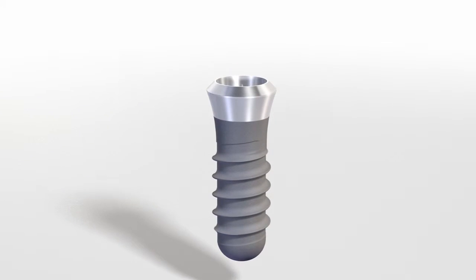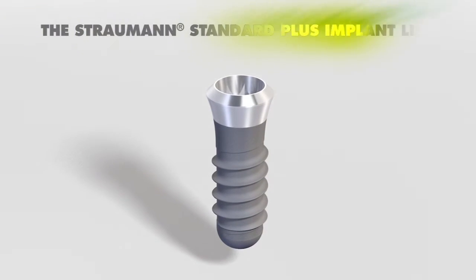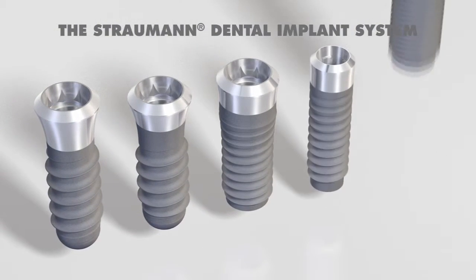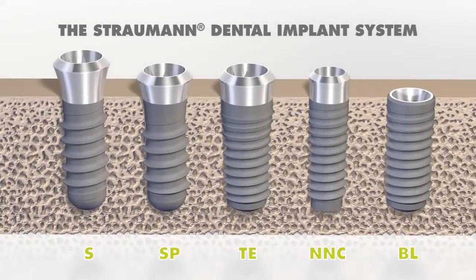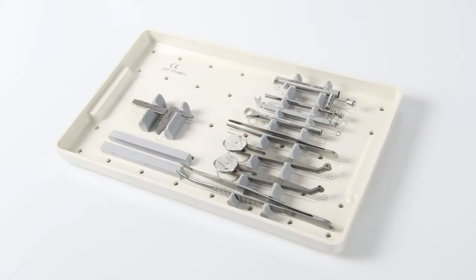This presentation demonstrates the correct handling of the Straumann dental implant system, focusing on the Straumann Standard Plus implant line. The Straumann dental implant system offers 5 implant lines with diverse body and neck designs, ranging from the tissue to the bone-level implant. All implants can be inserted with one surgical kit and require very similar surgical procedures.